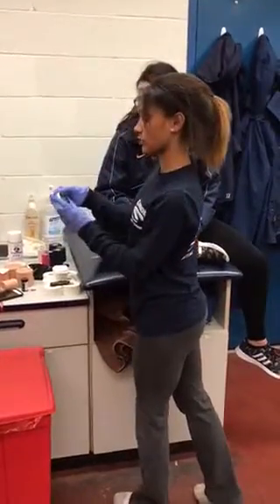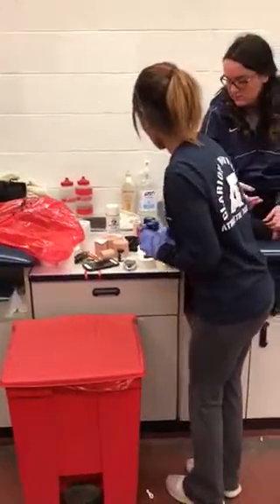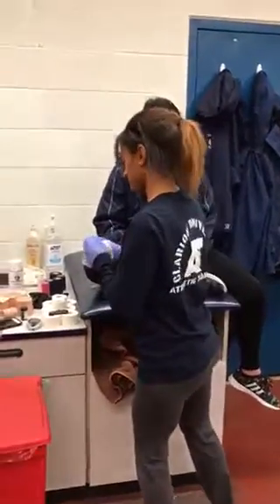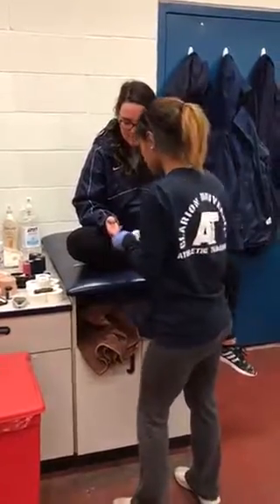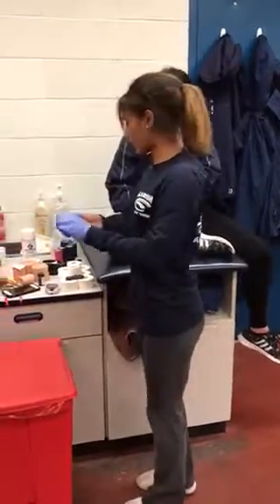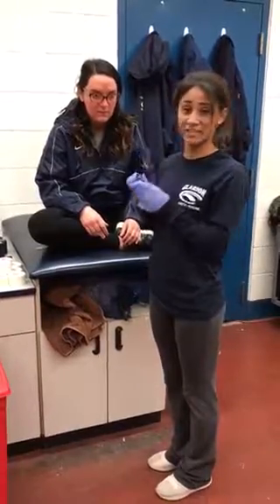And then we're going to take out this test strip and put it in our biohazard. Dry her off with the gauze pad. Put on a band-aid. And also remove the needle and add it into the sharps container.